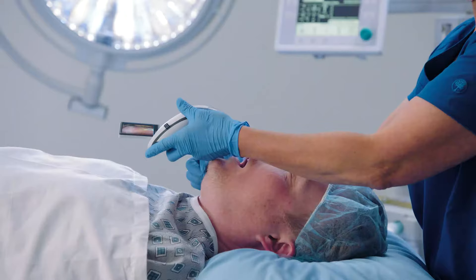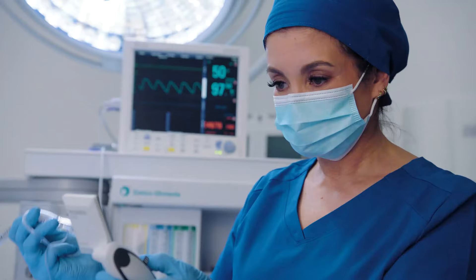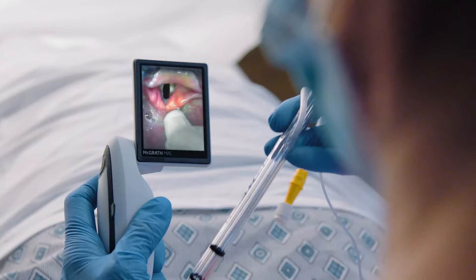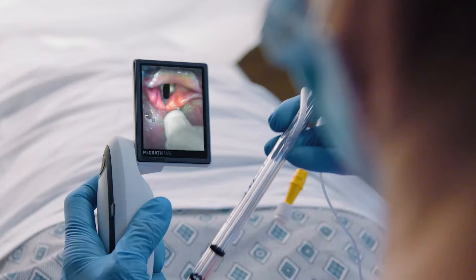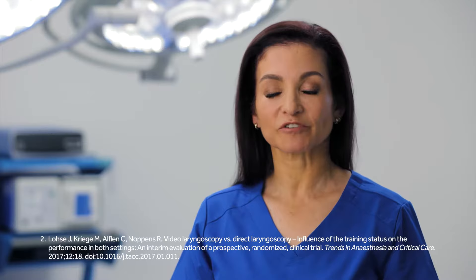The features of the McGrath MAC also help keep clinicians safe. Better airway visibility and an unchanged laryngoscopy technique enable clinicians to have higher first-pass intubation success. This means that the time spent performing laryngoscopy is reduced, minimizing the time spent over an open mouth and lessening the potential for droplet transmission.